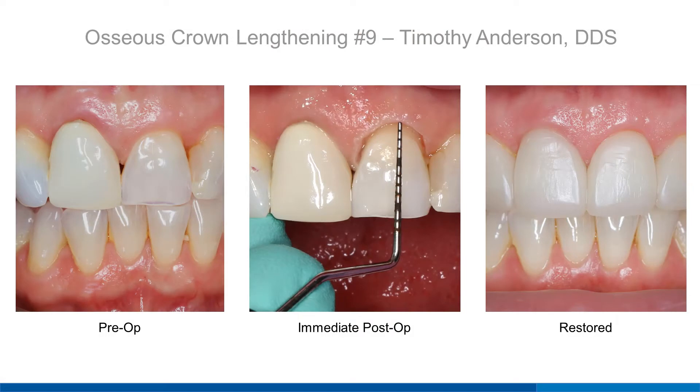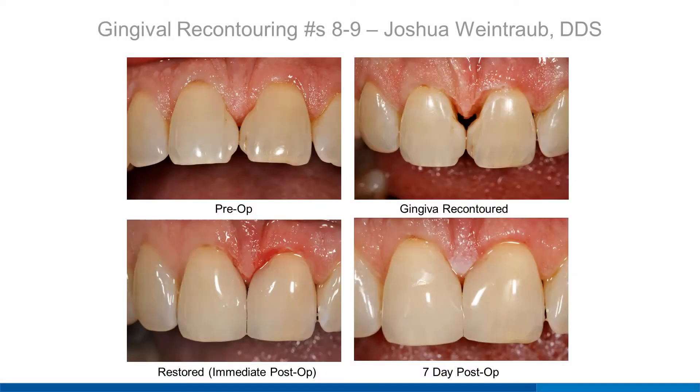With Solea, typically referred-out procedures such as crown lengthenings are easily incorporated into your practice. This closed crown lengthening on tooth number 9 was performed without the need for a flap in under 10 minutes and allowed for a true crown-in-a-day patient experience. Solea was used to precisely and atraumatically remove gingiva and bone. The sculpting of the gingiva was completed anesthesia-free, and Solea also easily removed the old composite. Such precise shaping of the tissue would be unattainable with any other device or instrumentation.